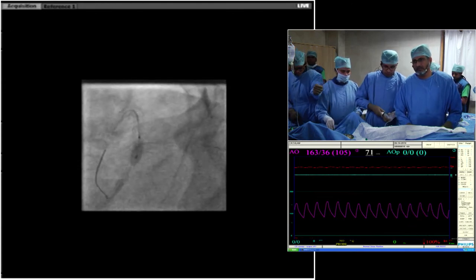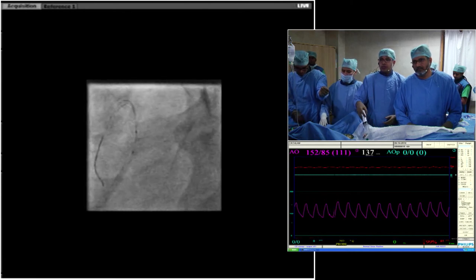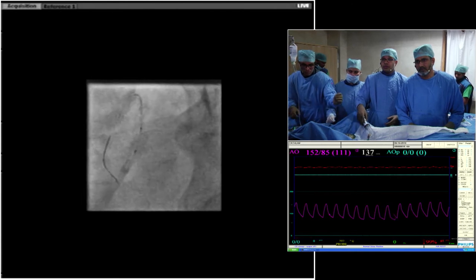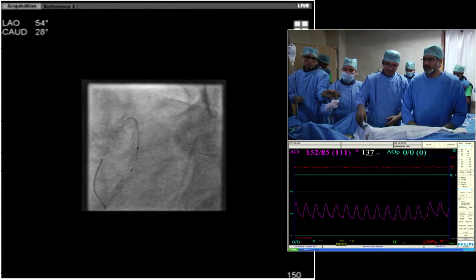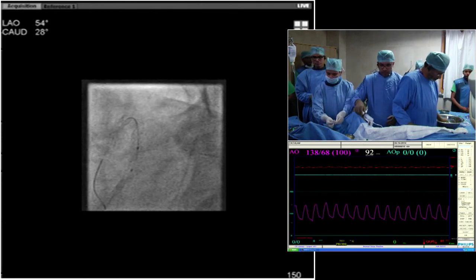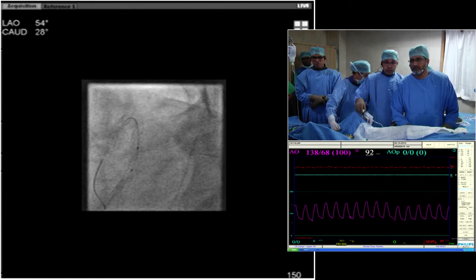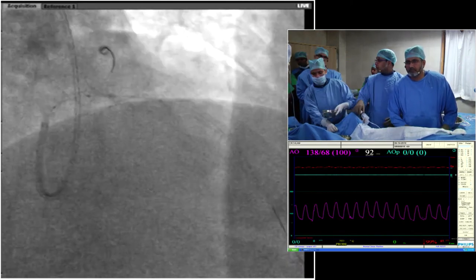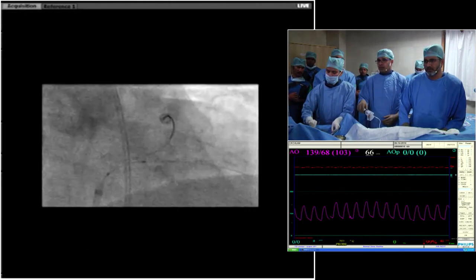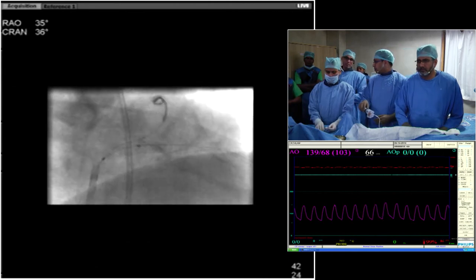Honestly, I think it's actually a smart move to start with the right coronary artery, as the team did, just to have a good backup in case you run into trouble with the left main. Please come to RAO cranial. Is the panel doing any main stem procedures under assist devices these days? What's the opinion on this? Well, I think in this case, clearly he has a good LV function, and we haven't planned for any assist device here.